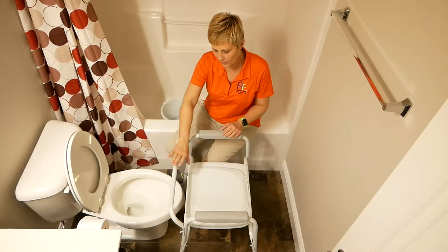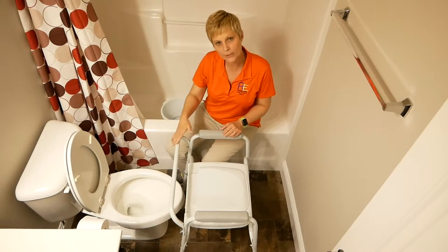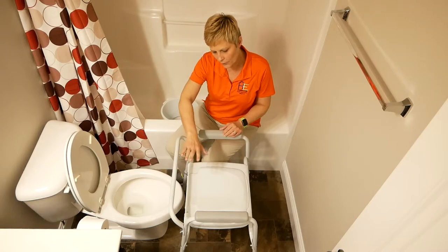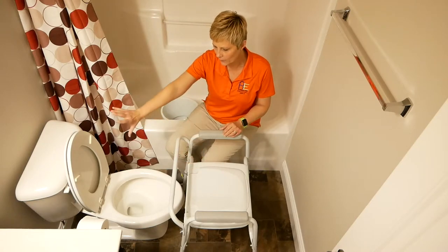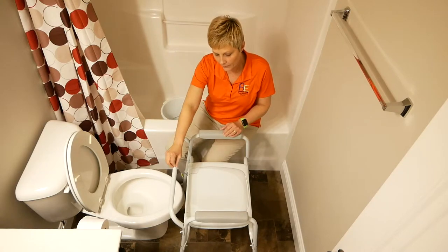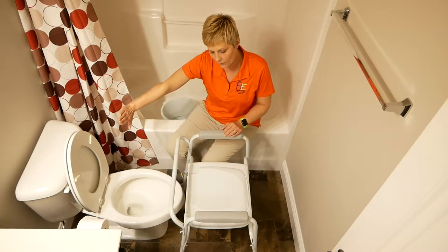If you need to do that and you don't have the room, this bar here can be removed. This is to protect you when you're using it as a bedside commode, but here you'll have the toilet back for back support. So this bar can be removed to get it moved back further over the toilet.